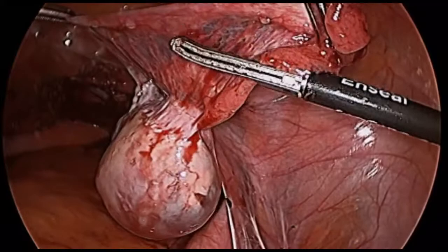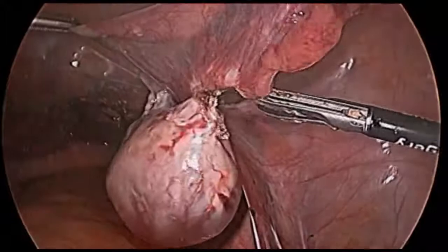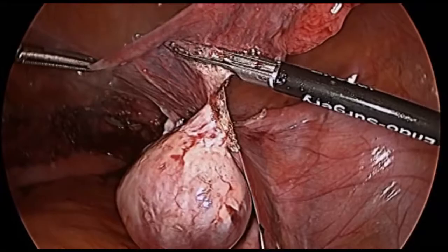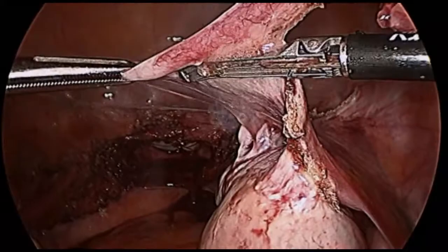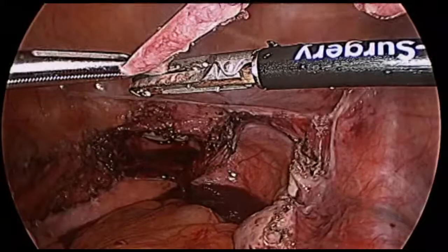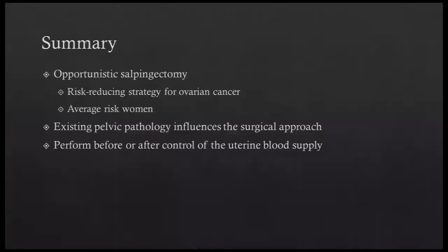Here we approach the dissection from the fimbriated end. The tissue is positioned in parallel to the vessel sealer, which is slid upward underneath the fimbriae to ensure that none are left behind. The vessel sealer is also positioned away from the IP ligament to avoid inadvertent injury. Care is taken to avoid dissecting near the blood supply of the ovary in order to prevent its devascularization. Since the vaginal cuff has not yet been closed, it provides a convenient way to remove the fallopian tubes.